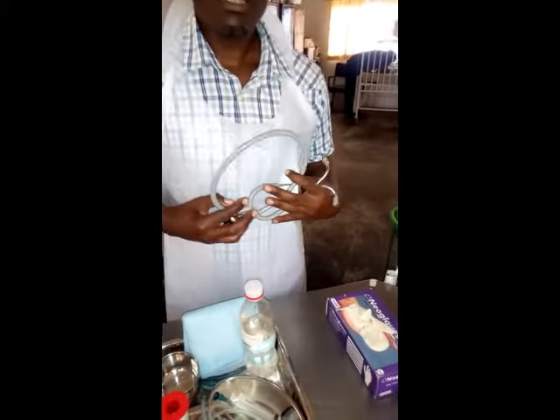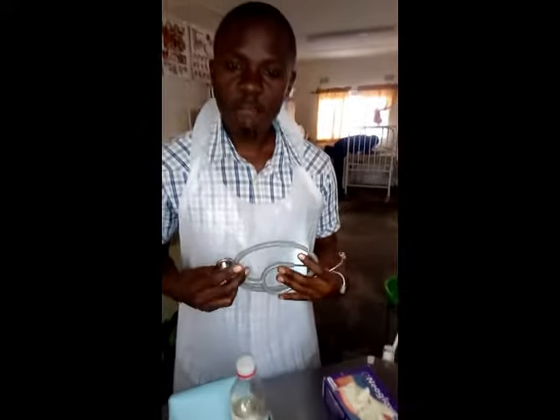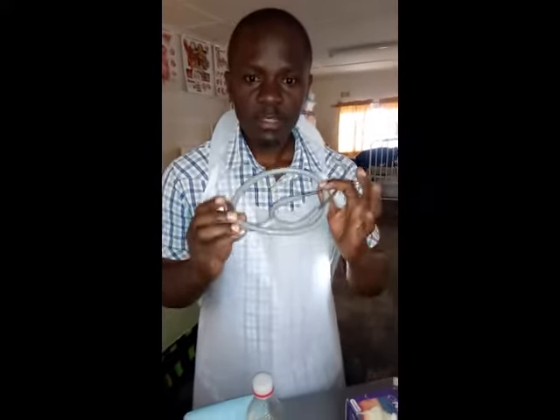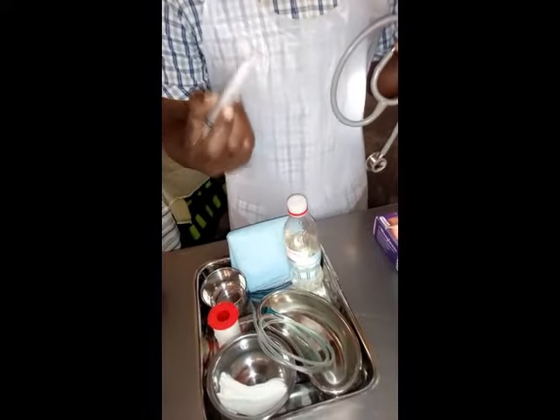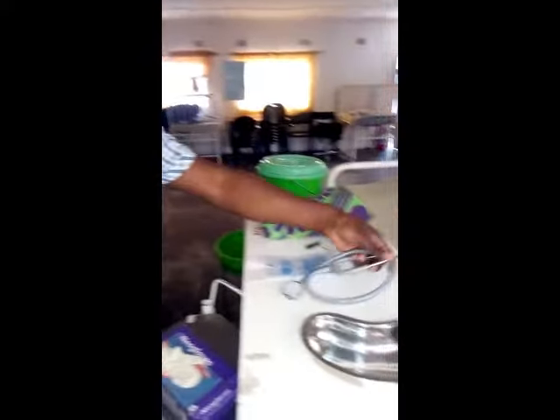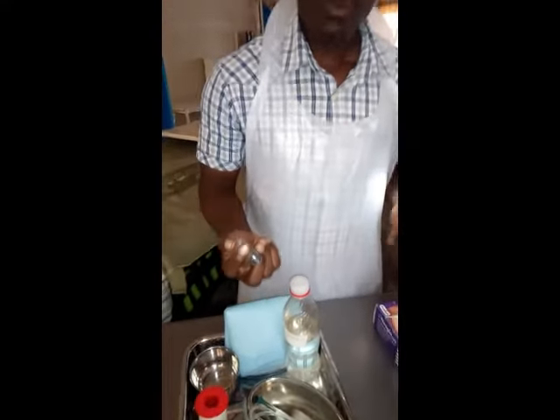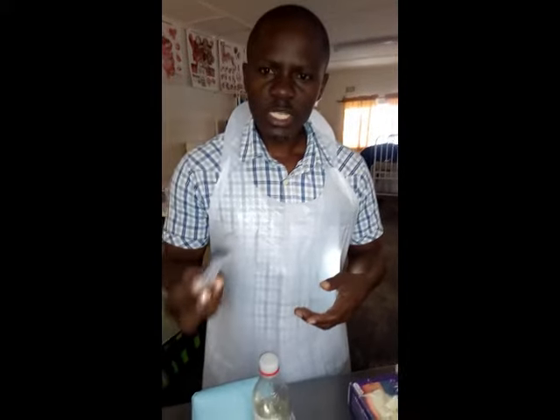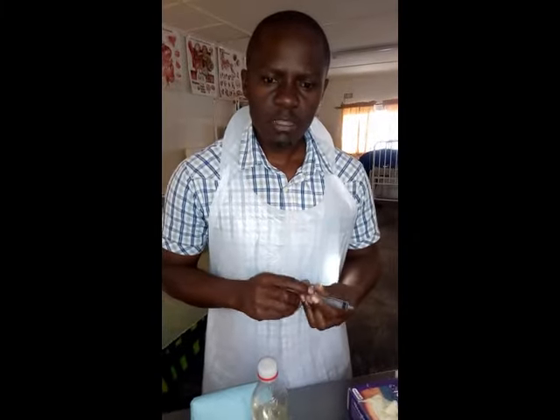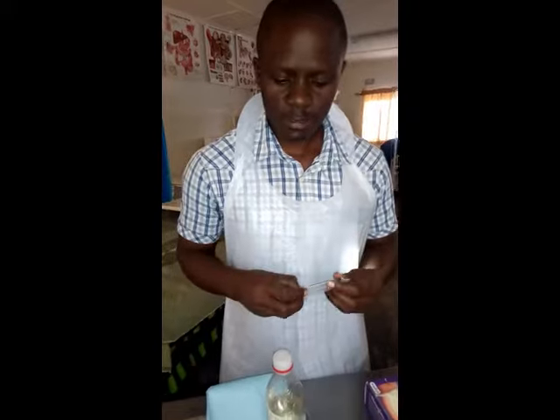But we said this is mostly for beginners and foundations. We're not going to use the stethoscope. For us, please, we're going to use a syringe for testing, not a nasogastric tube. And then we've got other items like litmus paper. If you aspirate gastric content, you can test it on litmus paper to check if the tube is inserted.